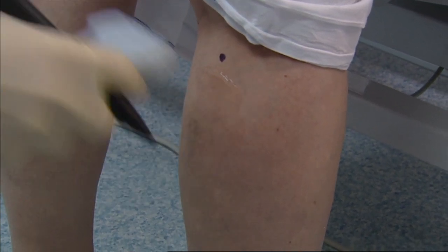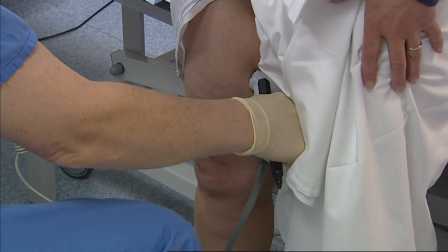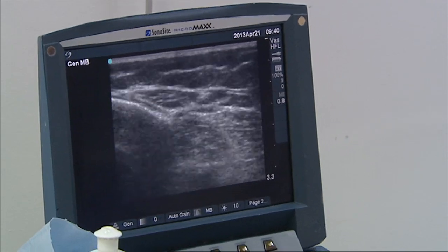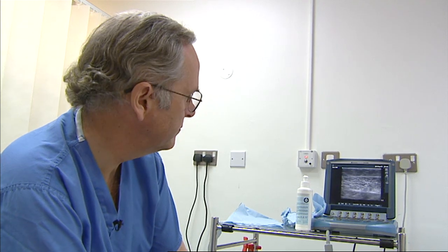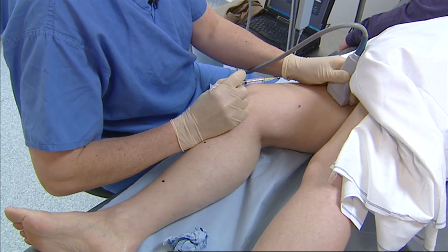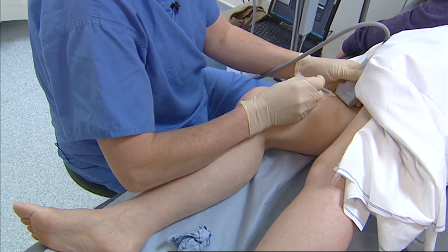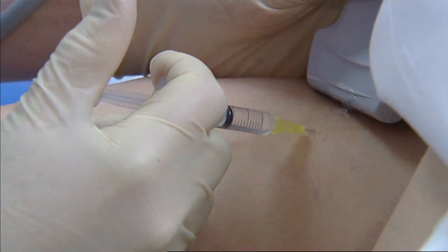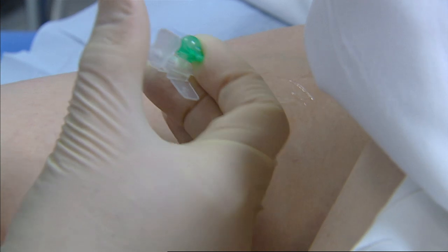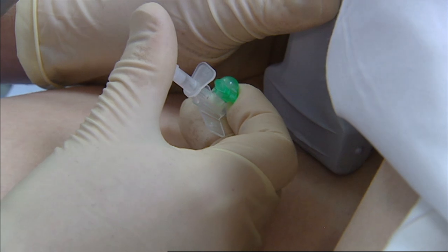There's a tributary there. So there's a picture of the saphenous vein inside the fascial envelope. Then we inject some local anesthetic at the sites of injection. The needles we put in are fairly small, so it wouldn't normally cause much discomfort. But if you're lying on a bed in a treatment room, having any needle stuck in your leg is potentially unpleasant. So we inject a small amount of local anesthetic at the places where we decide we're going to treat the veins.